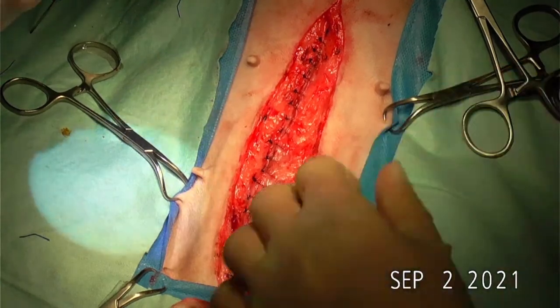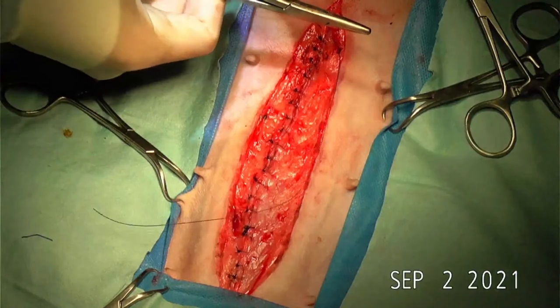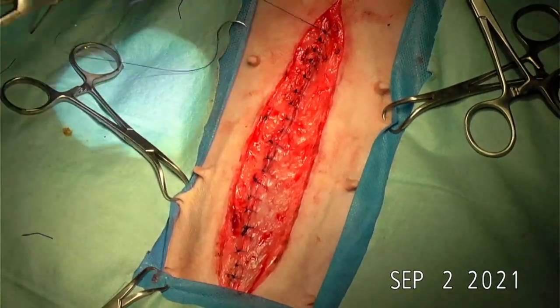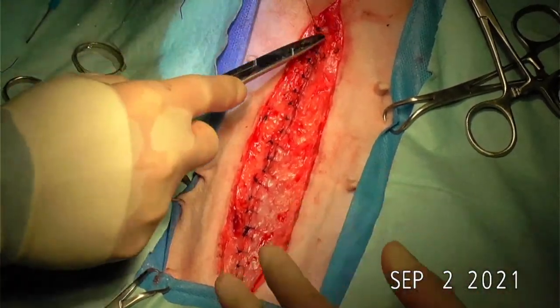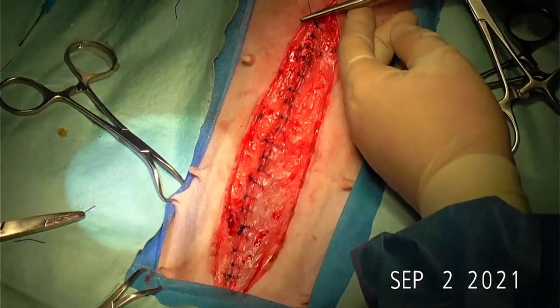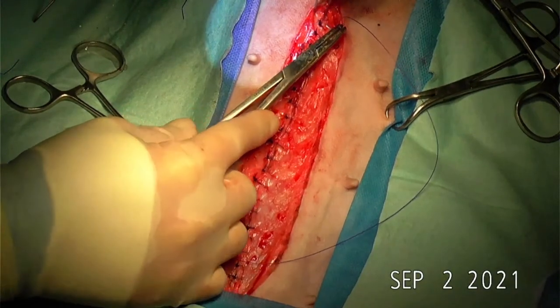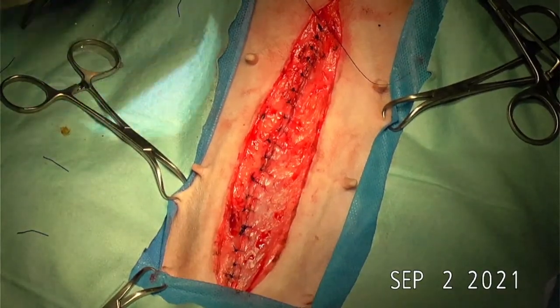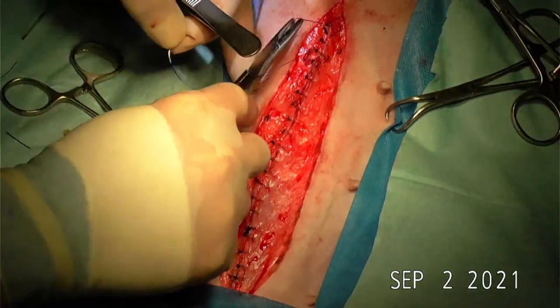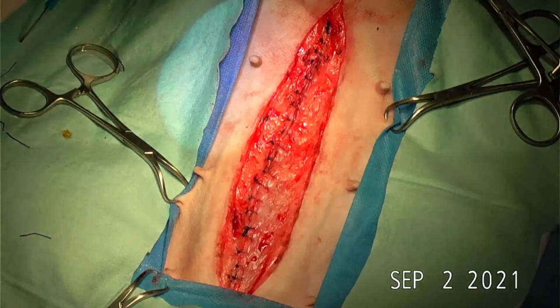So it's a big incision, like an explore lap, but since we don't see any sign of leakage, the sewing needle with its thread is still inside and didn't perforate any part of the small intestine or large intestine, so we just remove it by a small pinpoint incision in the area of the ileocecal junction where the needle was located, and we close the small incision with thread. Okay, and the colon with a 3-0 PDS, simple continuous and interrupted.